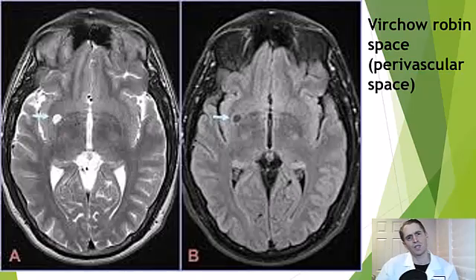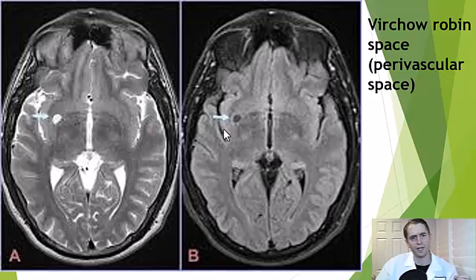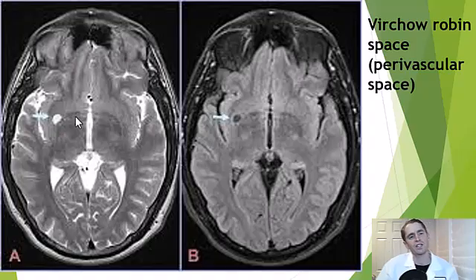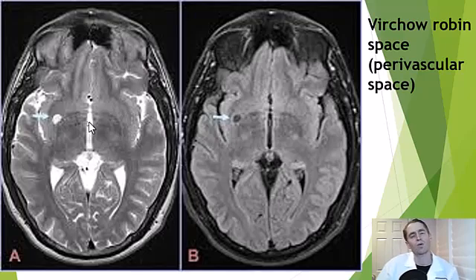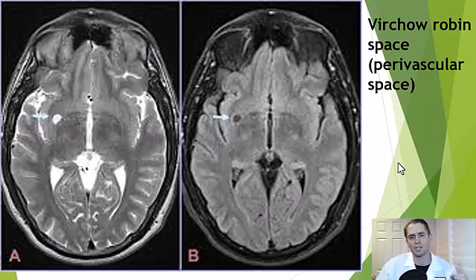Arachnoid granulations are the tissue that allows resorption of the cerebrospinal fluid back into the venous system — completely harmless. Sometimes we see cerebrospinal fluid structures deep within the brain tissue that could mimic a small old stroke, but these are actually benign perivascular spaces, or collections of normal cerebrospinal fluid around the blood vessels, also known as Virchow-Robin spaces.